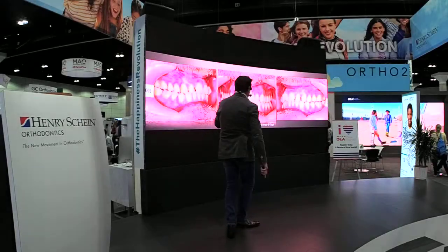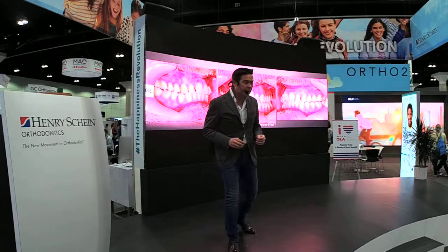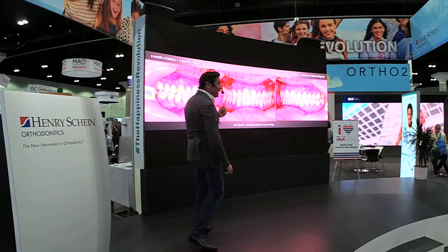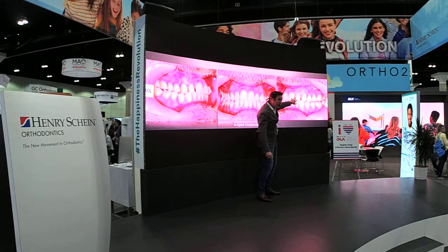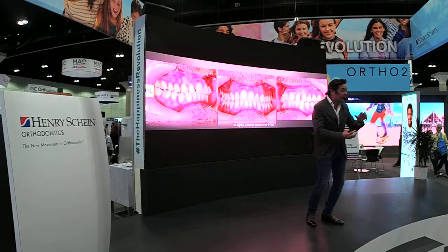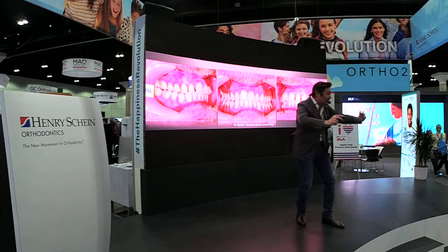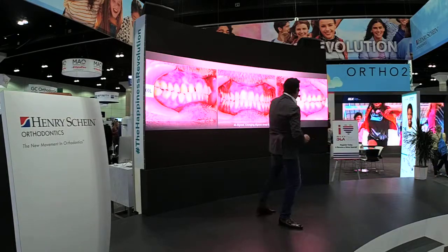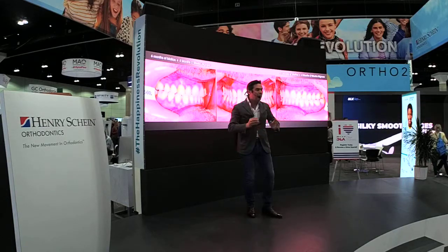So how many aligners did we receive? 28 aligners. We submitted this particular case to Invisalign at that time, and we received 28 aligners. So the interesting point is that when you have spaces in between the incisors, the amazing part is that we can change aligners every 5 days, and they will not lose track, because they are going to have a magnificent efficiency, because what is easy to solve are spaces. So this means that we were changing aligners every 5 days, and it was 4.5 months of aligners.